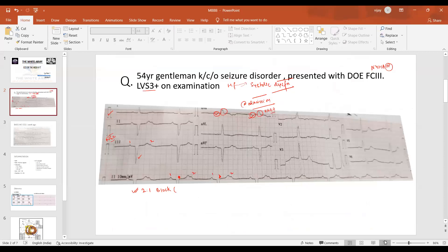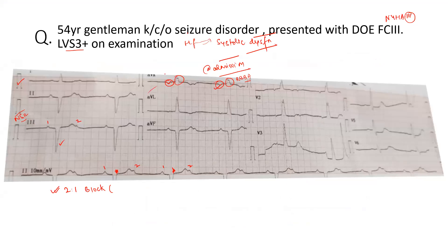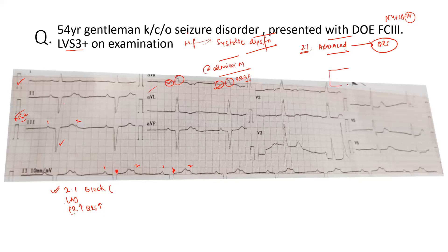There is 2:1 AV conduction. Whenever there is a 2:1 AV block, it is some sort of advanced degree of block because for every two P waves, only one is being conducted. We have to look at the QRS, whether it is narrow or wide. This will tell us if the block is at the supra-hissian or infra-hissian level. Any block at the infra-hissian level is a severe conduction defect and will require emergency permanent pacemaker insertion.